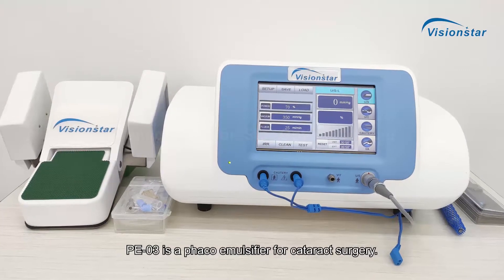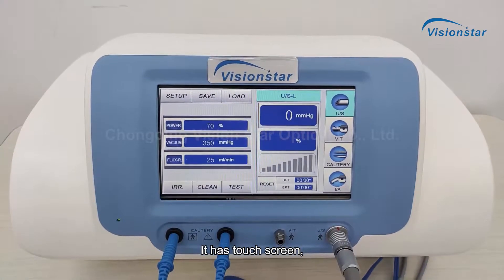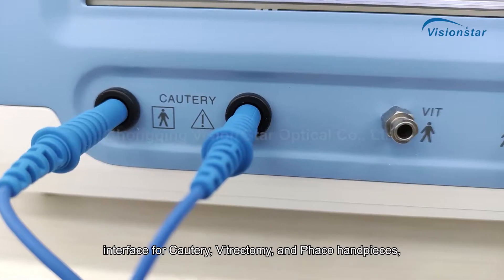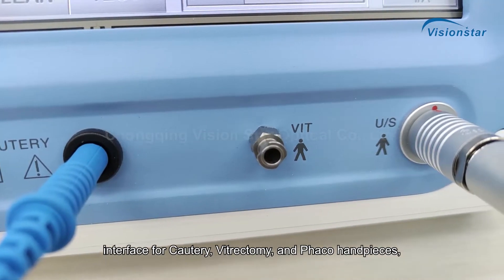PE03 is a FACO emulsifier for cataract surgery. It has a touch screen interface for cautery, vitrectomy, and FACO handpieces.